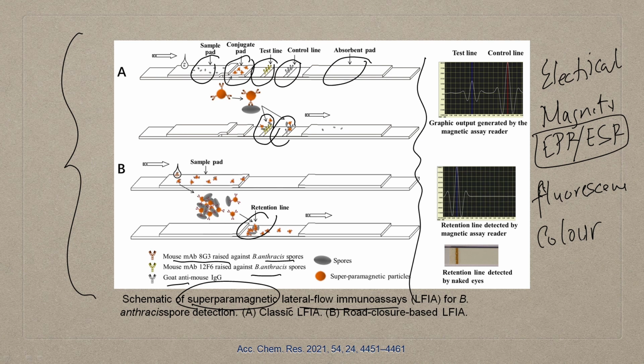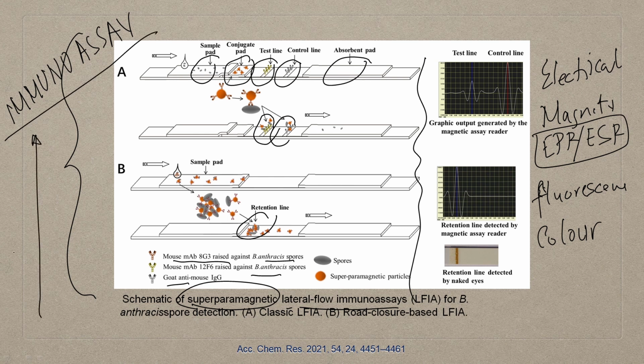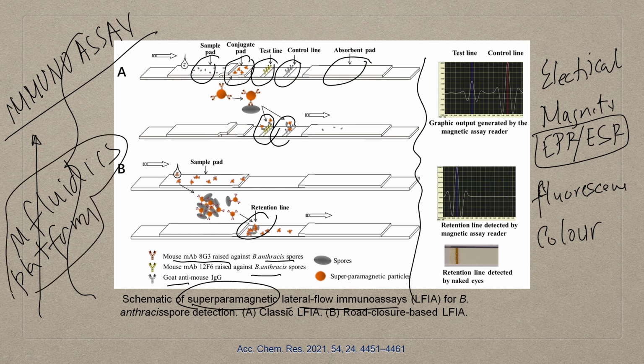Apart from it, we have talked about other techniques in the previous classes, but end of the day, the basic understanding is it's a simple immunoassay technique which is being further modified on a microfluidic platform. And mind it, these are not newer techniques, it is just that the miniaturization is the newer part. Otherwise, radioimmunoassay, RIA, or ELISA, enzyme linked immunosorbent assay, these are all old techniques.